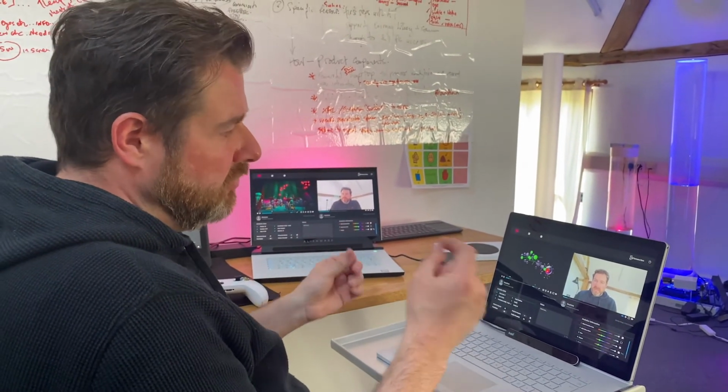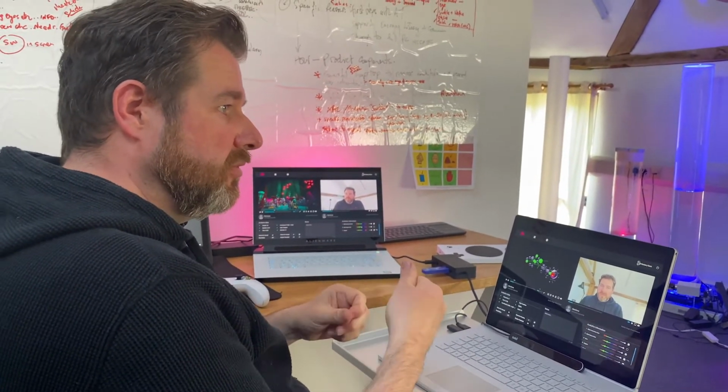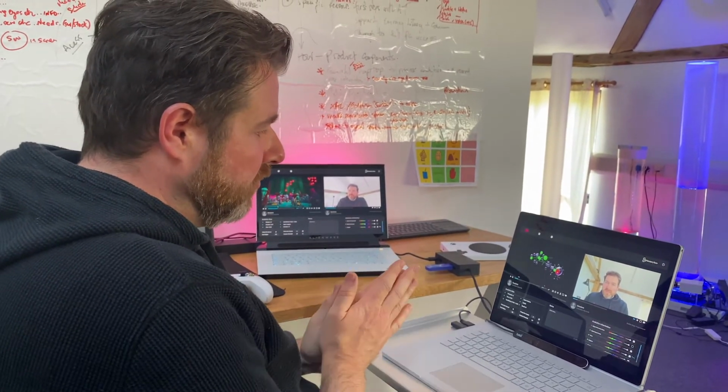We can basically use this information to see how long it's taken people to respond to different stimuli and interact with it. So you get all of this information from it.